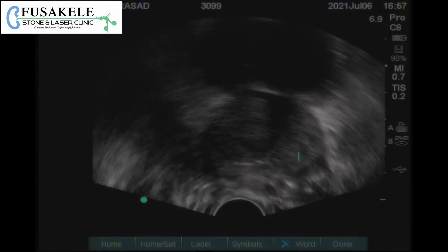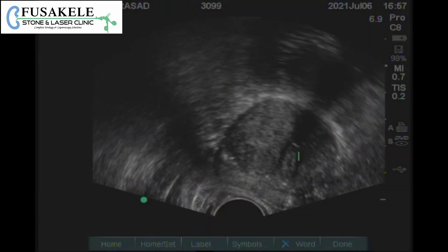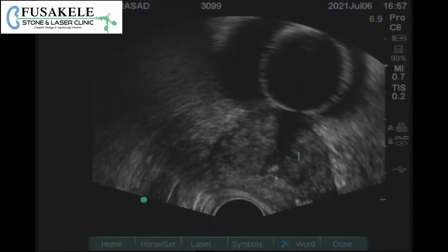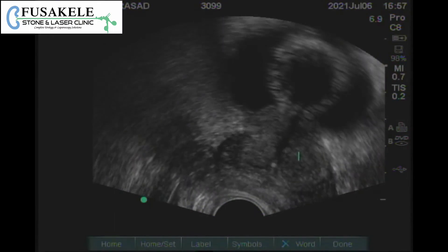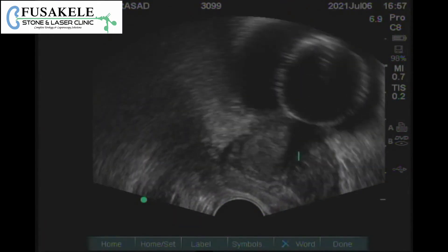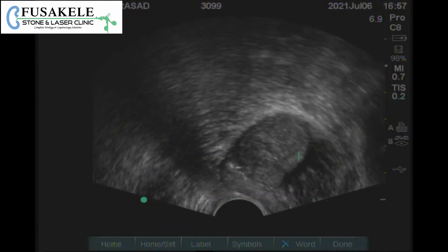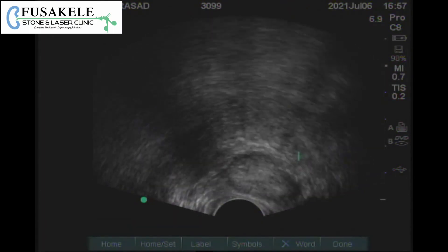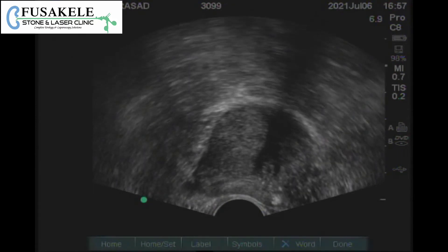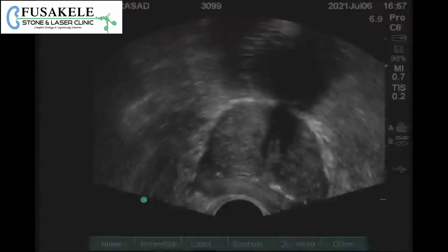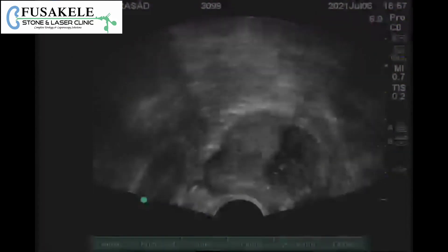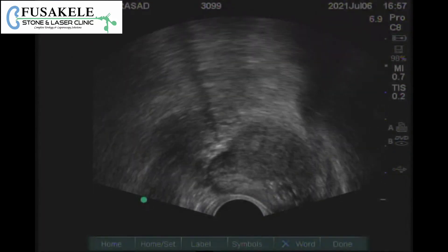We have to look for the capsule — whether there is any infiltration, any hypoechoic nodule, abscess, or cyst. We have also seen the median lobe. This is the Foley's catheter balloon in the urethra, which we can trace up to the Foley's valve.